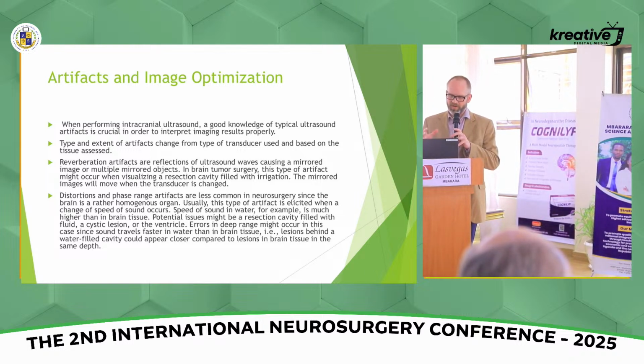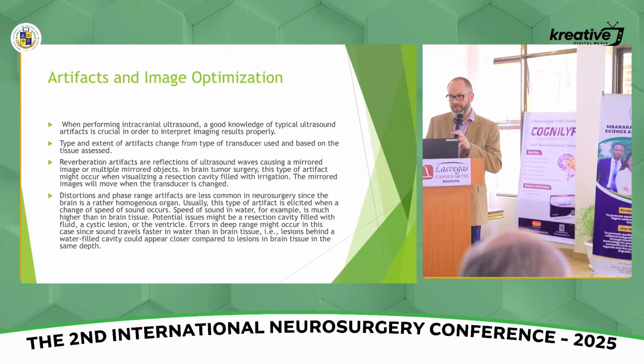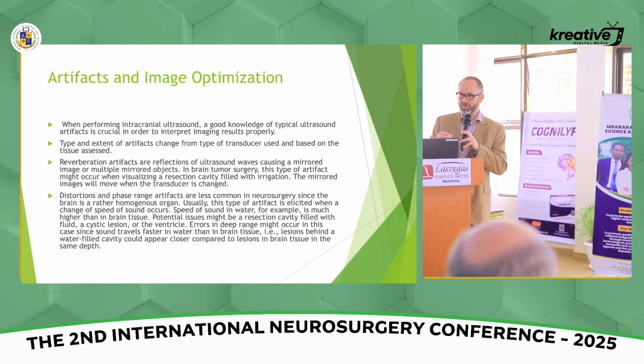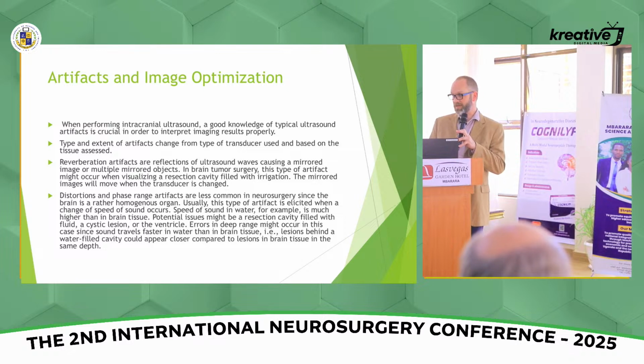I find if you suddenly see the brain swelling around you at surgery and you don't know quite what's going on, ultrasound's very helpful. You pull it right over, you look, you can see a big hematoma if there's a hemorrhage, you can see hydrocephalus developing, right? And then you can even pass a catheter into the ventricle of the brain to drain that ventricle if necessary. Especially because at surgery, you're often in a strange position to use anatomy to find your ventricle.